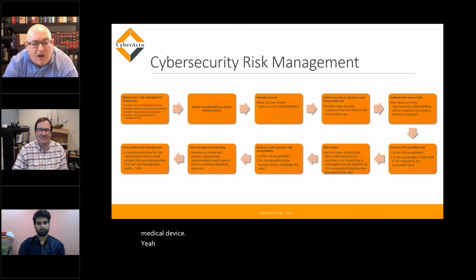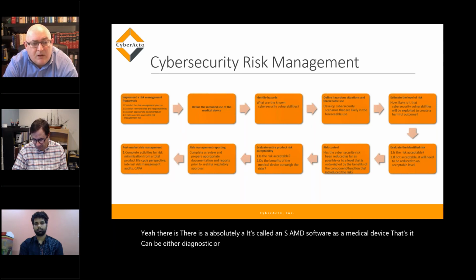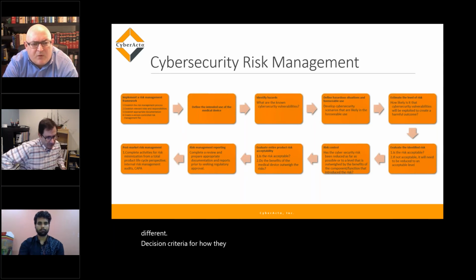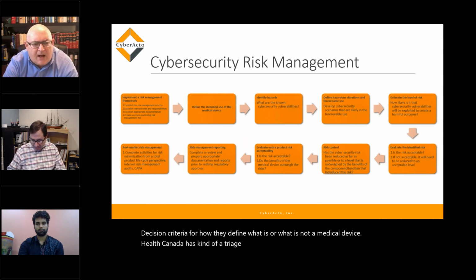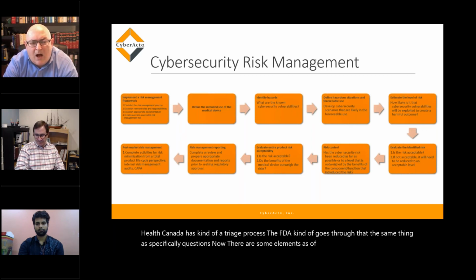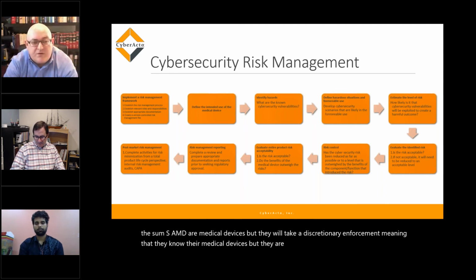Yes, absolutely, it's called SaMD, software as a medical device. It can be either a diagnostic or a medical device, standalone. Each region has different decision criteria for how they define what is or is not a medical device. Health Canada has a triage process. The FDA goes through the same thing, asking specific questions. Now, as of right now, the FDA has deemed that some SaMD are medical devices, but they take discretionary enforcement, meaning they know they're medical devices, but at this moment they choose not to enforce it.